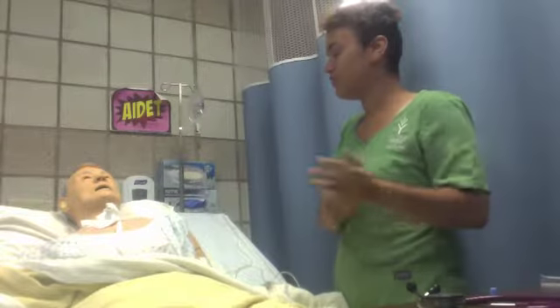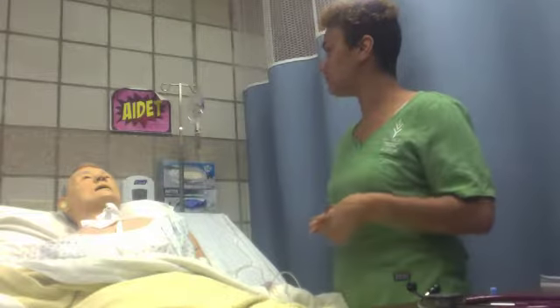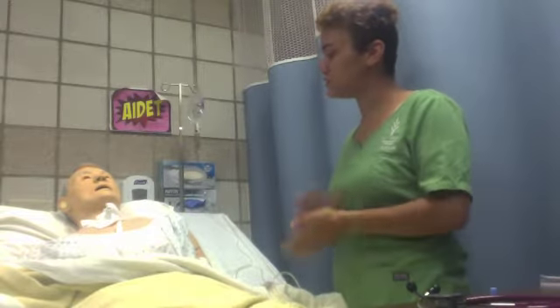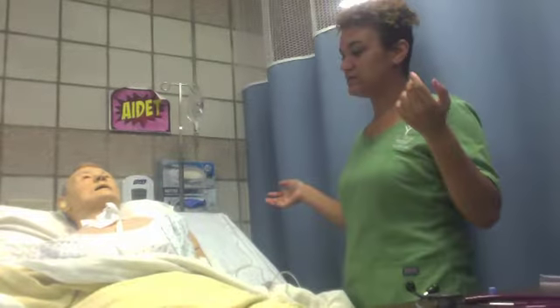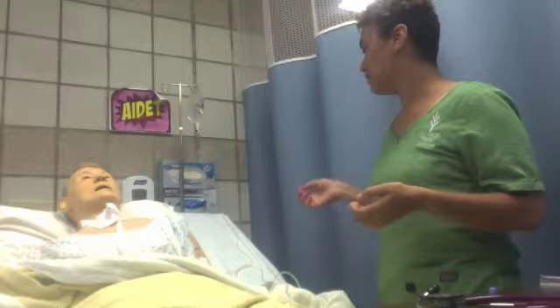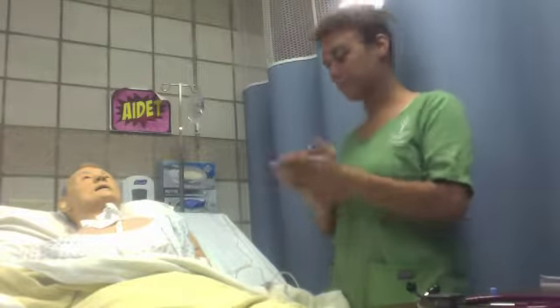So now I'm going to perform hand hygiene, and I'm going to be in here for about 15 minutes or so, maybe less. I'm just going to give you a once-over, a look-over, and make sure that everything is running smoothly, okay? Do you have any questions at this time? No? Okay, at this time I'd raise the bed to an appropriate level for me, and then lower the bed rail on the side of the arm so I can get a good look at it.